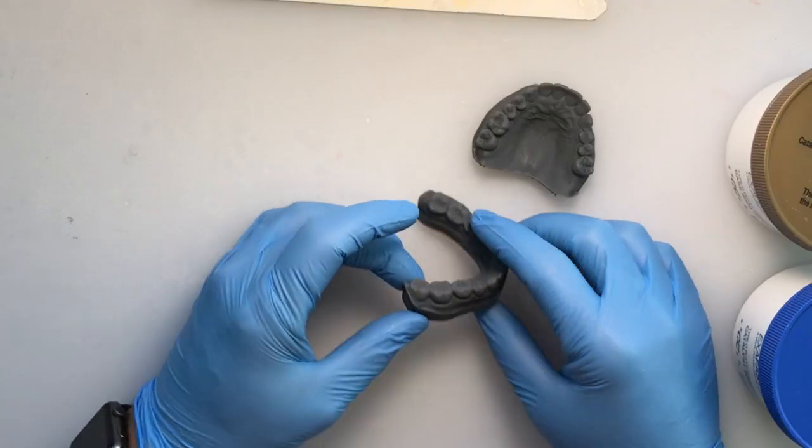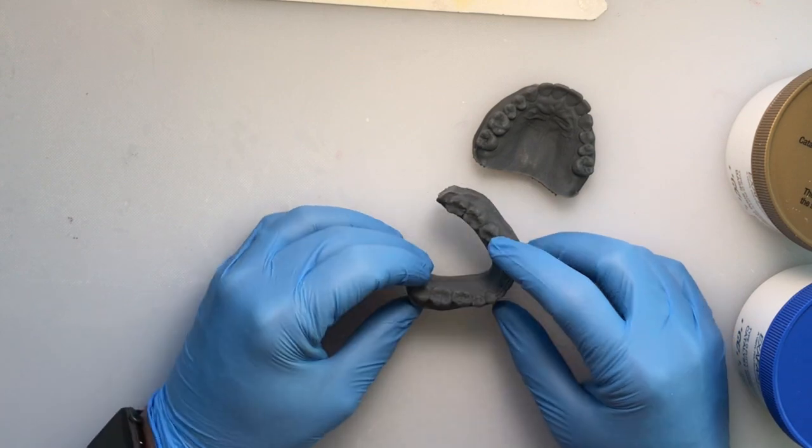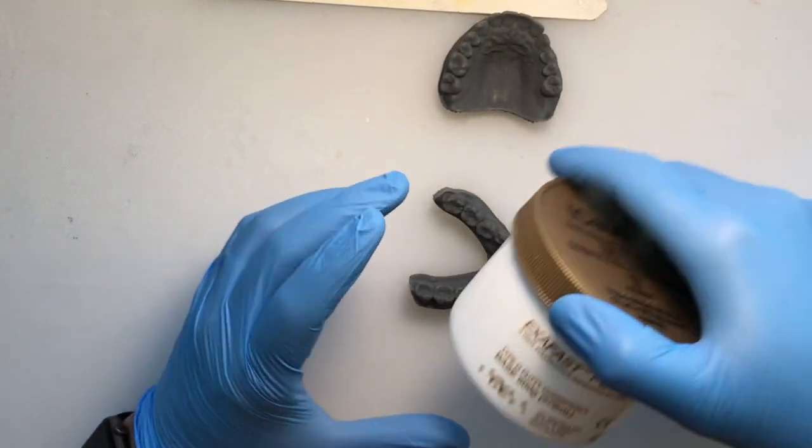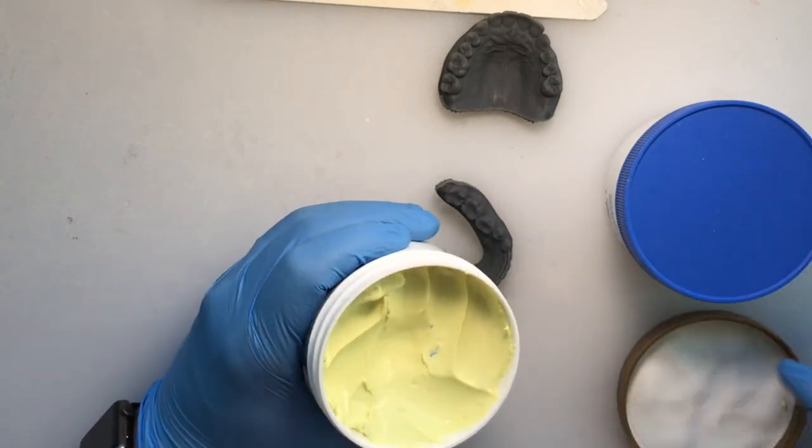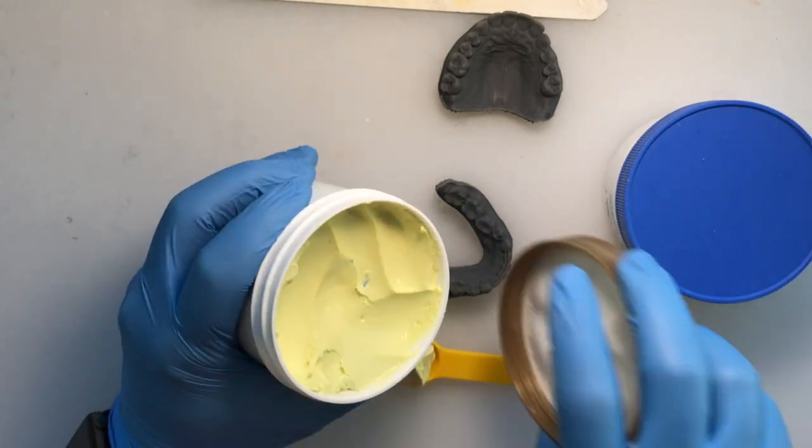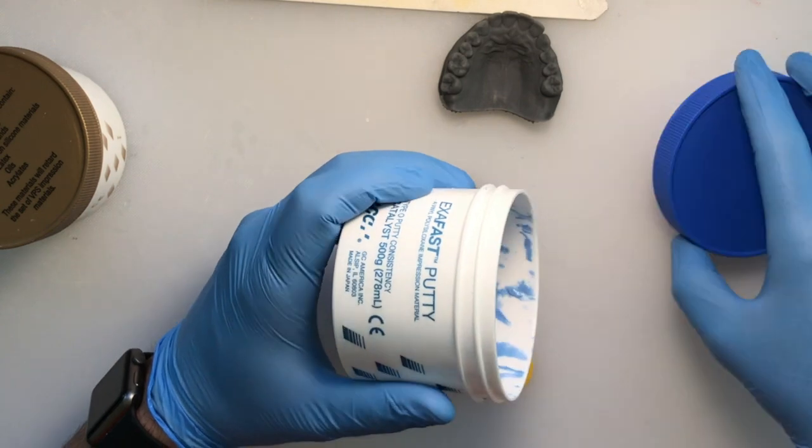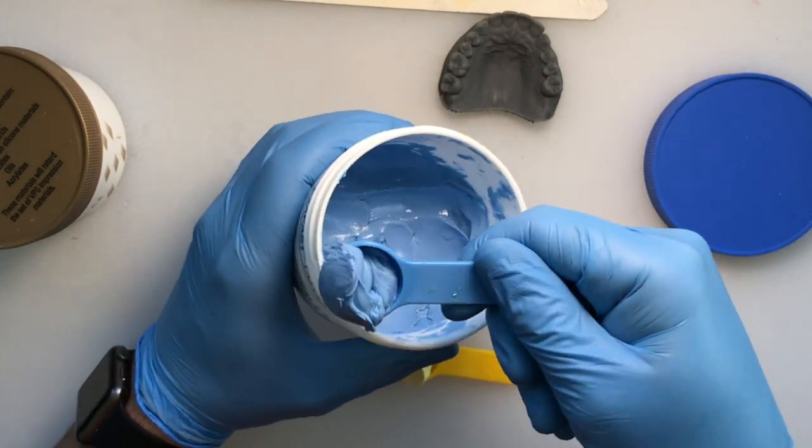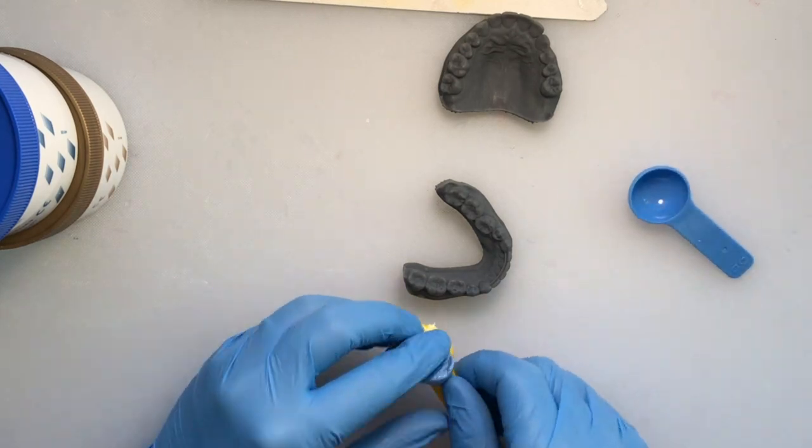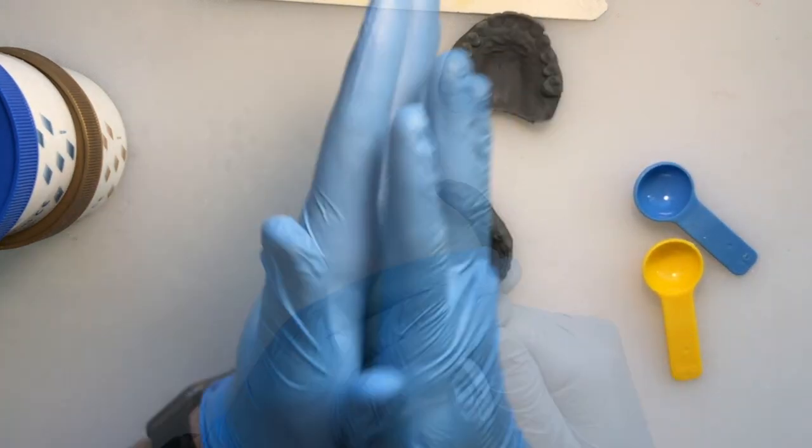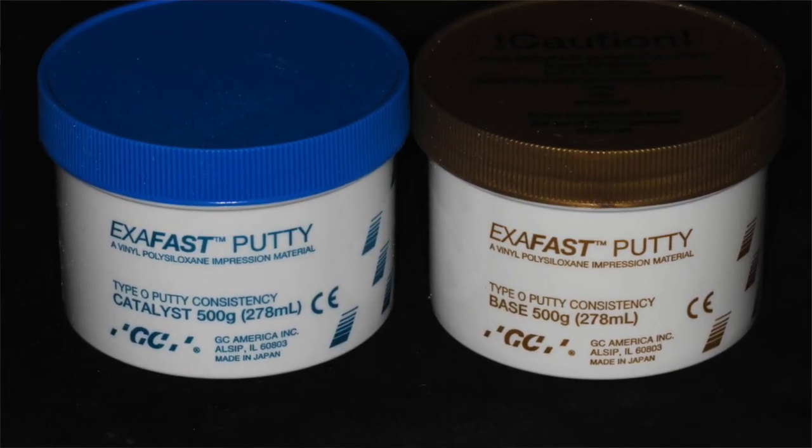I'm going to demonstrate using a model on the benchtop how to make a temporary crown using the GC America Temp Smart BIS-GMA material. You always need to make a matrix. I personally like the GC America ExaFast polyvinyl siloxane putty.